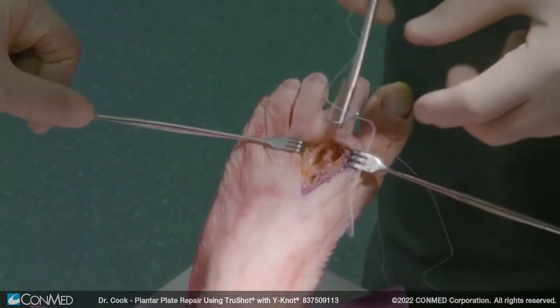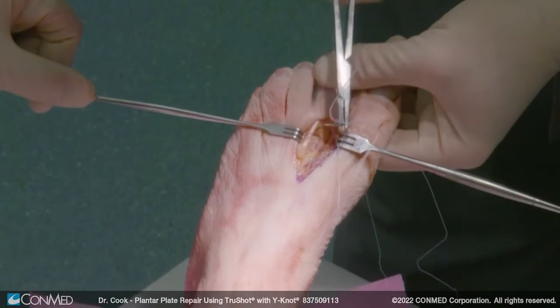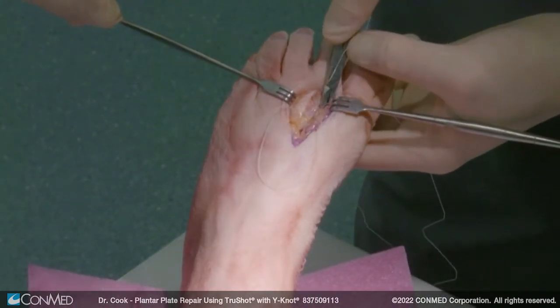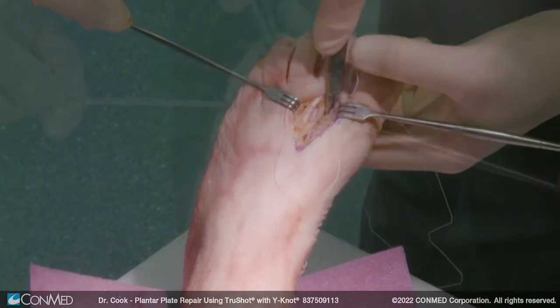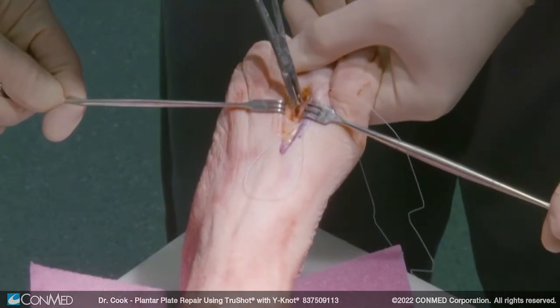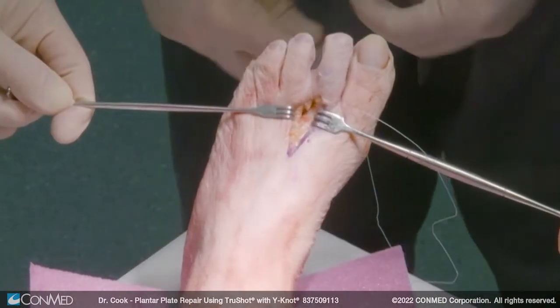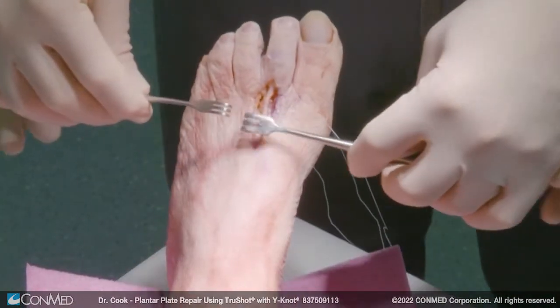You see your metatarsal head, so you want to stay proximal to that, and march down until you can pass it — you feel it pass around. Now we've passed the two sutures medial to lateral. At this point, we create our Weil osteotomy.